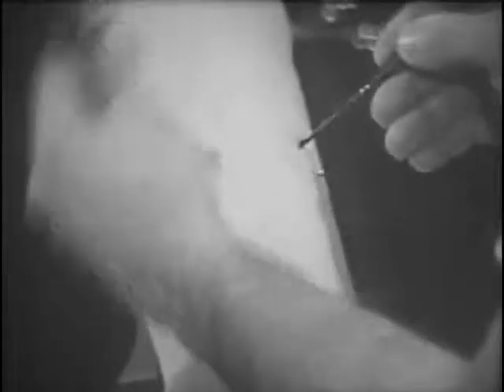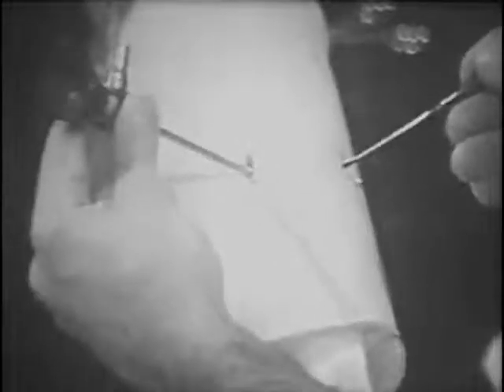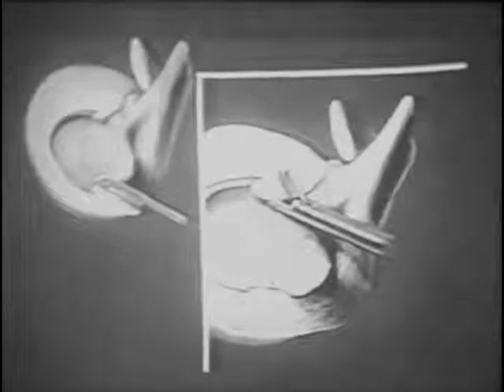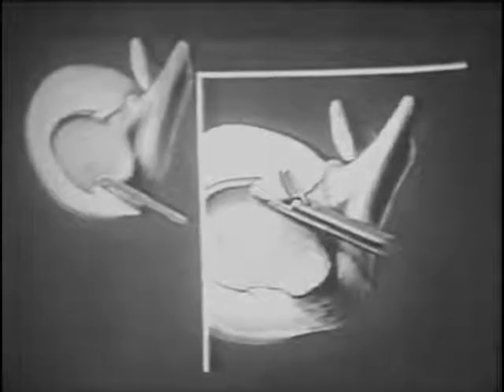The nerve hook is utilized to probe the remaining meniscus to ensure there are no loose fragments. To trim any loose material, a five millimeter basket forceps is inserted through the lateral portal. This has a large biting surface and can resect large portions of meniscus at a time, demonstrated here by removing a segment of the posterior horn.